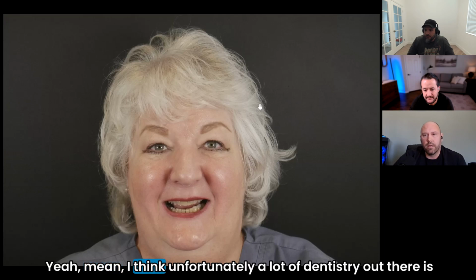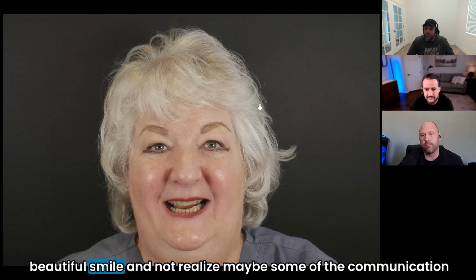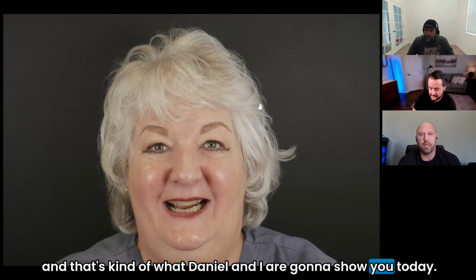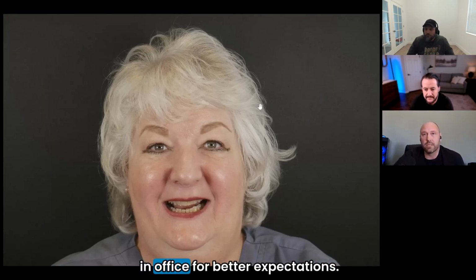Yeah, I think unfortunately a lot of dentistry out there is like, hey, we'll sling it to the lab and let them create this beautiful smile, and not realize some of the communication that is entailed there. There's a lot of legwork on the front end for the doctor, really, and that's kind of what Daniel and I are going to show you today. There's smile design that we can work on that you can do in office for better expectations.